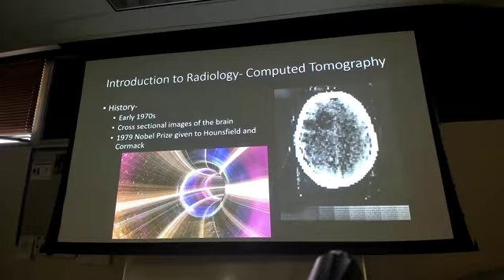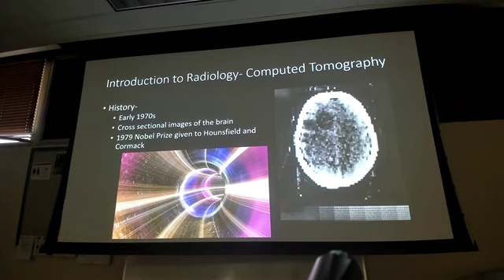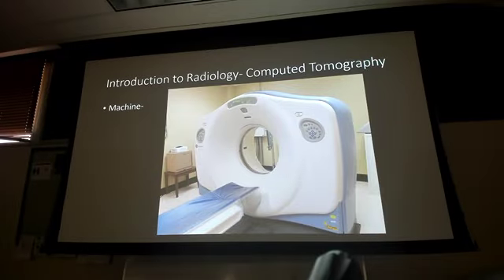A commonly used way is that sometimes on a CT you'll see a mass, and you're like, I don't really know, is that a cyst, is that something else? If you don't give contrast, it can be hard to tell. Well, you can put that little marker over there, and cysts are usually filled with some type of water or water-based substance, and masses are more tissue. So you can determine just by looking at the density, is that probably a cyst, or is that probably a mass that needs further evaluation? You'll see that when you get into your radiology rotation, or internal medicine, or maybe even ER when you're ordering these studies. It's a really cool tool to help you evaluate these. That's what it looks like.